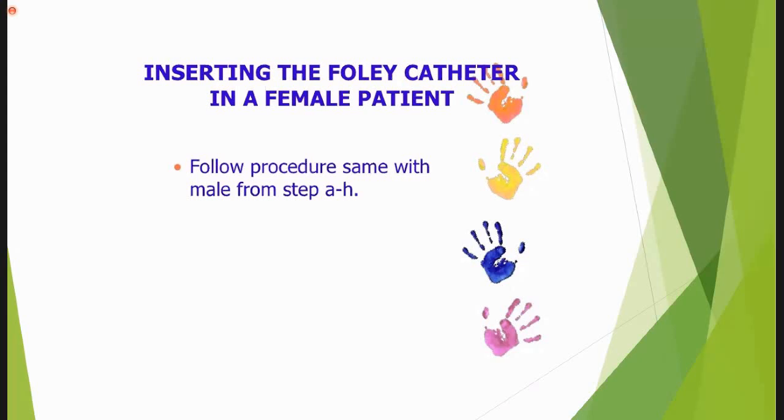And what was the procedure? Firstly, introduce yourself, wash your hands, take consent, wear the gloves, maintain the sterility, gather all the equipment, and check the balloon patency with the syringe, and all of these things in the male patient procedure. Now we can move towards the female patient.